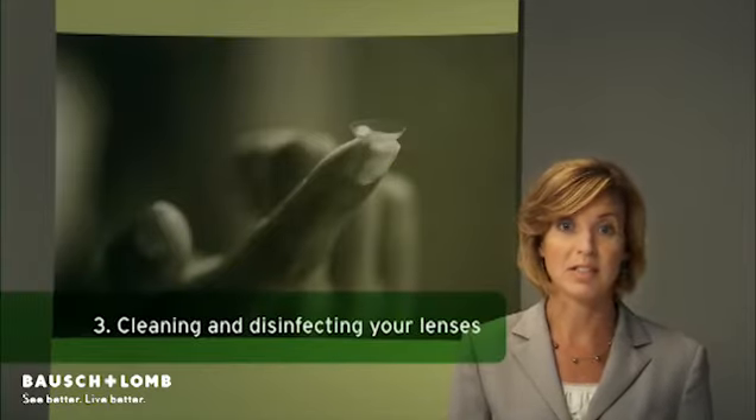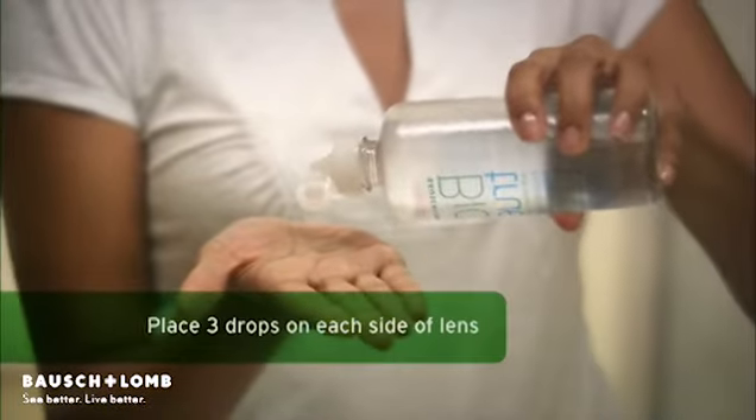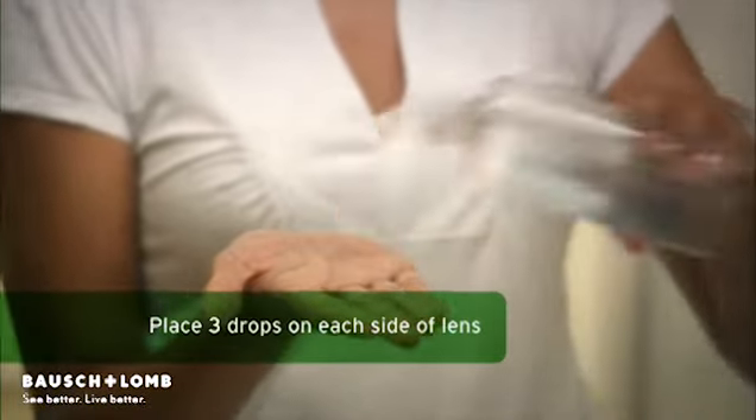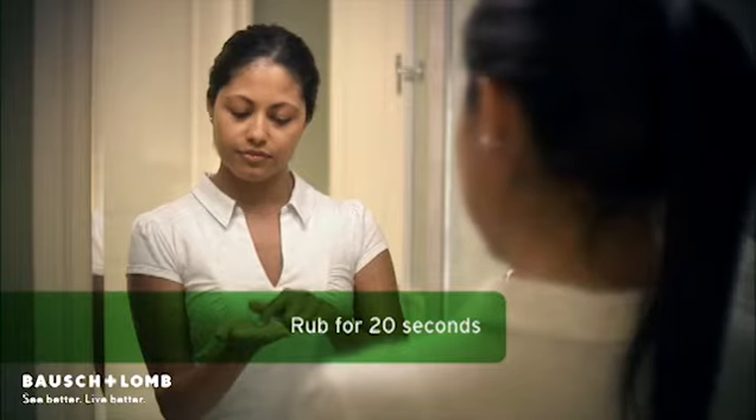Now that you've removed your lenses, you'll need to clean and disinfect them. Remember to do this after each use to keep your lenses comfortable and your eyes healthy. First, place at least 3 drops of Biotrue Multipurpose Solution on each side of the lens surface and gently rub in a back and forth motion for 20 seconds.